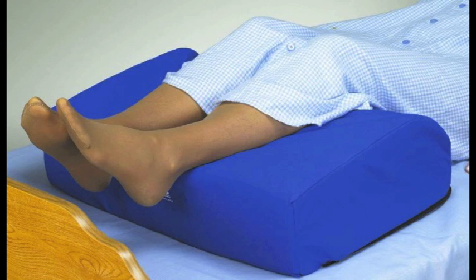Some interventions listed in the guideline for patients who score a 3 or less are as follows. Elevate heels off the surface of the bed at all times, even when using a therapeutic support surface. Use pillows, therapeutic pressure offloading devices, or devices especially designed for the client. Support the knees to avoid hyperextension when heels are elevated. Heel elevation in bed is especially important for clients with diabetes mellitus, peripheral vascular disease, neuropathy, and during and following surgery. Do not use rolled blankets, towels, pillowcases, incontinent pads, or IV bags to elevate heels. Heel protectors provide protection from friction and shear, but not from pressure, as they do not elevate the heels off of the bed.